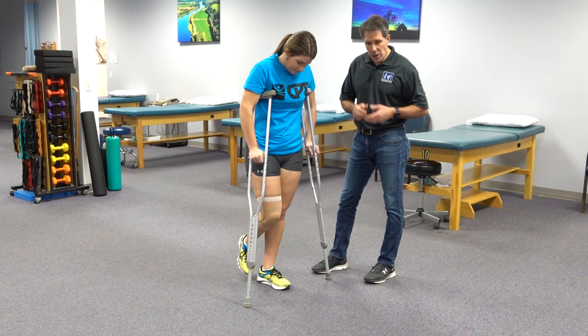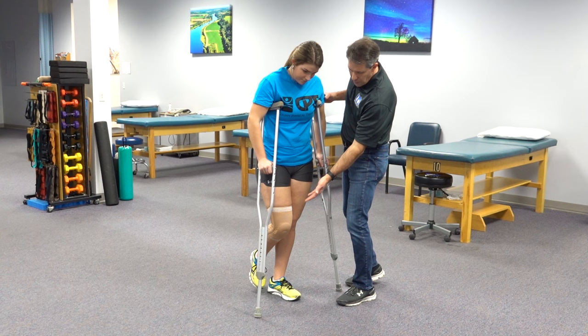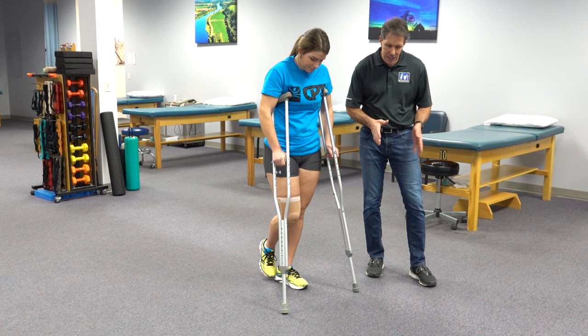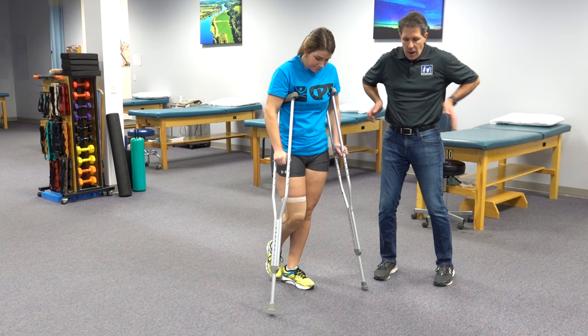This is the affected leg on the right side. We want to make sure that she is not putting any weight on the floor whatsoever. When she takes her step, she is going to bring her crutches forward approximately 6 inches ahead and 6 inches out to each side. She is going to pitch the crutches in toward her rib cage a little bit, just to give some stability while doing this.